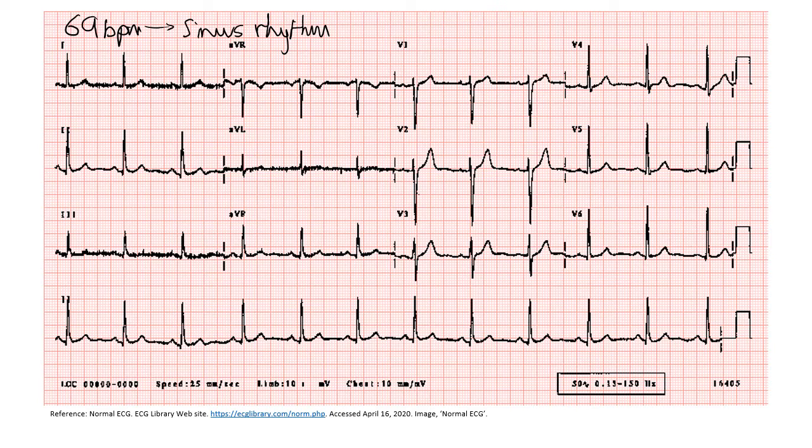If we take the heart as being here, it takes the heart signals to be that way, lead 2 is that way. Now lead 3 on the other hand takes heart signals that way, and essentially it shows if there's any indication of a right axis deviation on our heart, which can signify the presence of right ventricular hypertrophy or any other pathology associated with the right side of the heart.